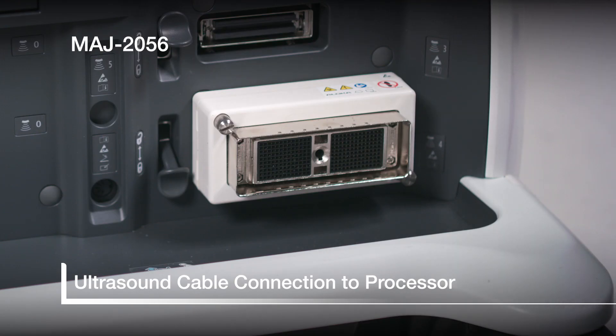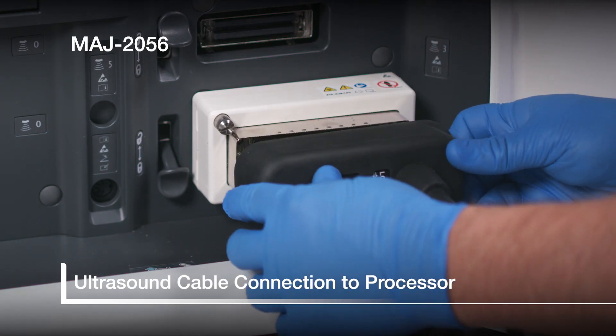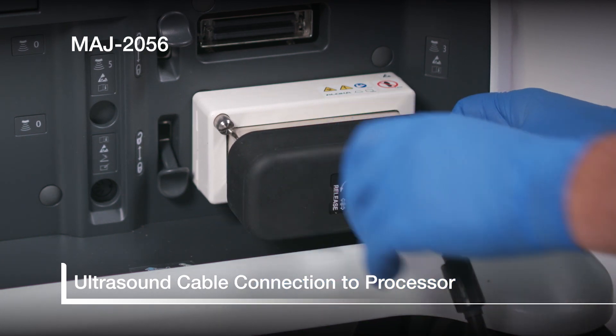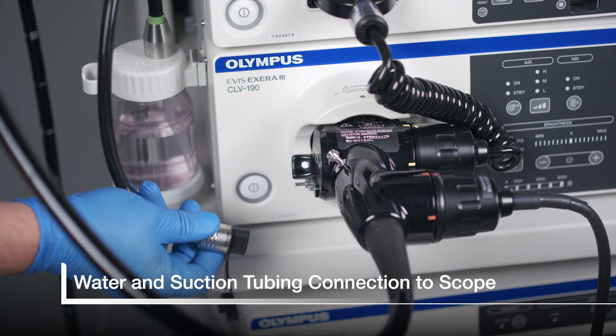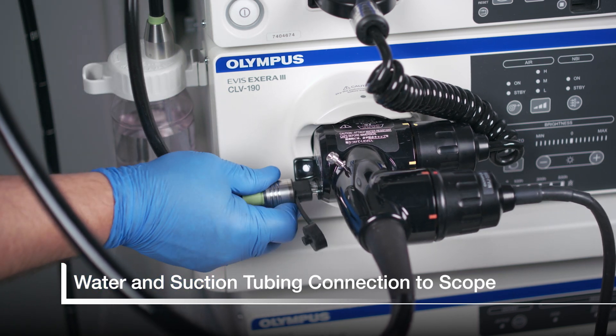To connect the detachable ultrasound cable to the EUS processor, insert and turn the lever from release to lock. Finally, we will connect the water and suction tubing to the scope.